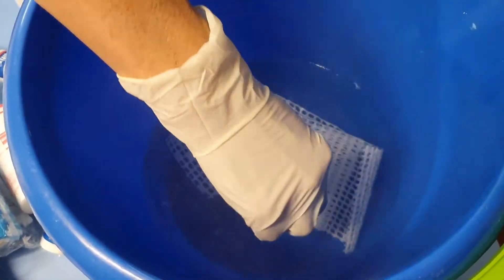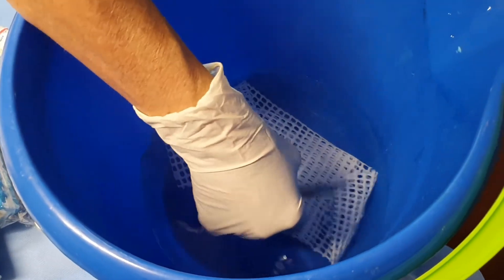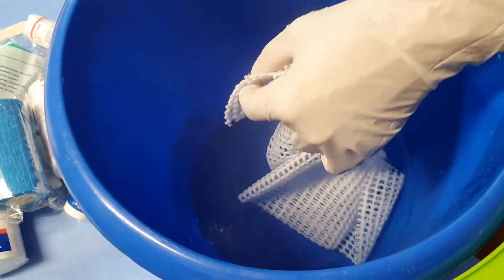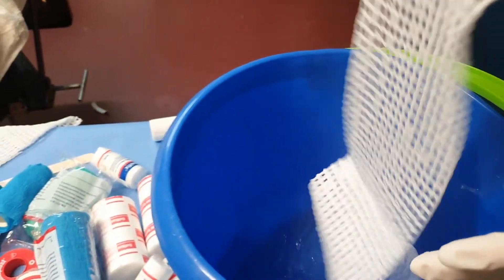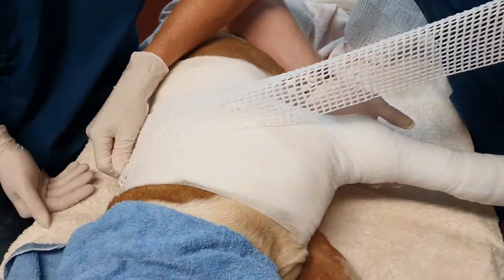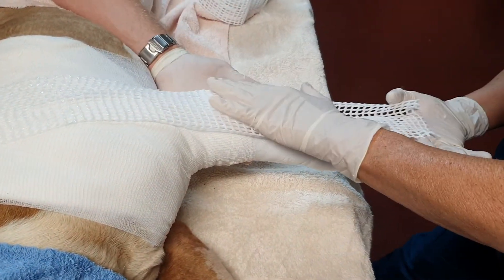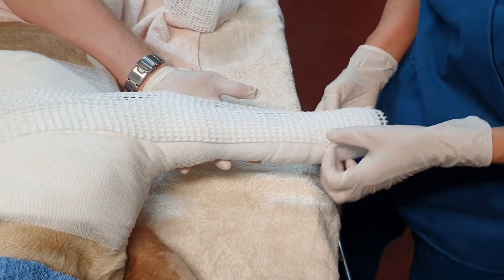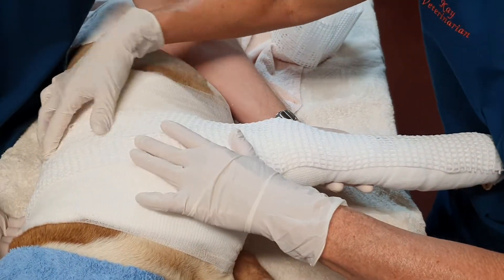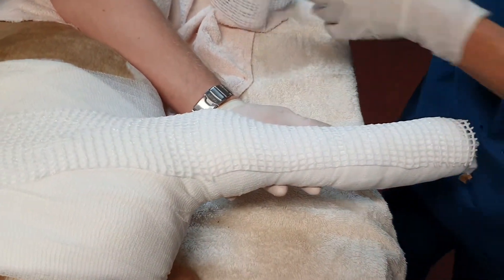I have instruments ready. It doesn't take long to go soft. I think that's nice and soft there. I'm just going to do this layer by layer. Yes, it does make the underneath bandaging a bit wet, but because we're using hydrophobic layers it dries out very quickly. I have my assistant holding things in the position I want, making sure the leg is parallel to the body. This needs to be nice and flat — no divots that will cause pressure sores.